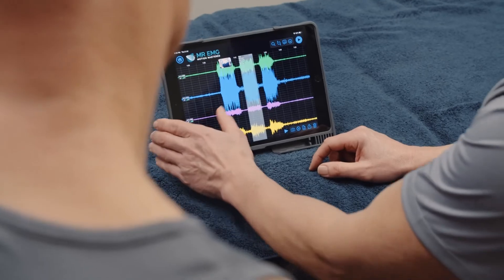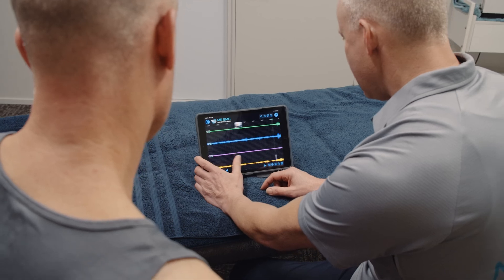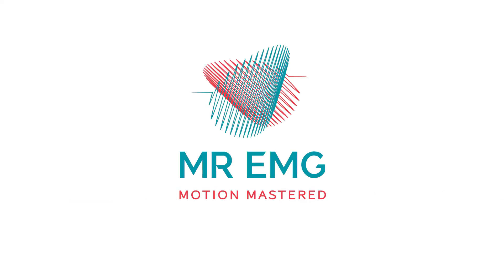To conclude the assessment, we recommend you sit down with your subject and analyze their data, identifying any muscle activity during movements you feel is related to their symptoms. We hope you enjoy using MR-EMG.